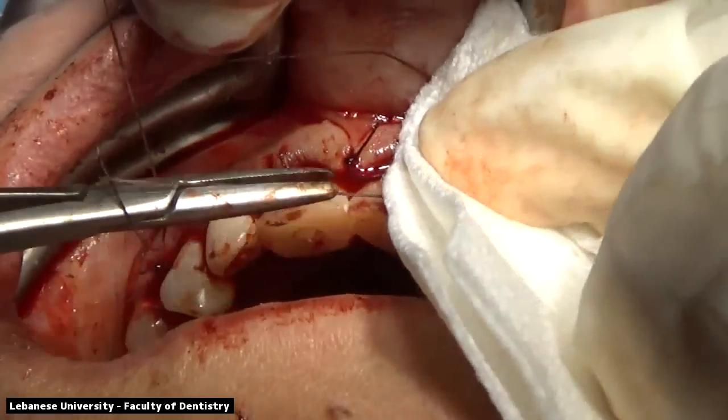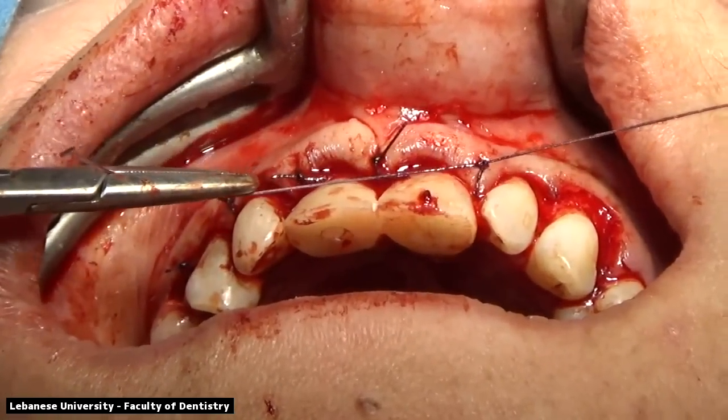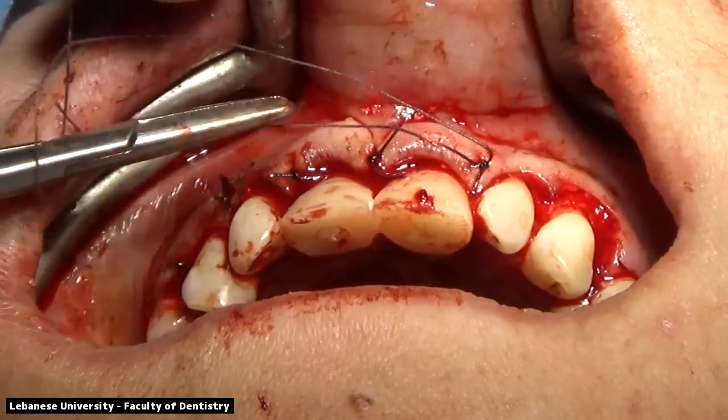See the pull and the closure of the papillas. We're almost done. There's one more papilla to close, and you can see the lack of tension at the papilla side.